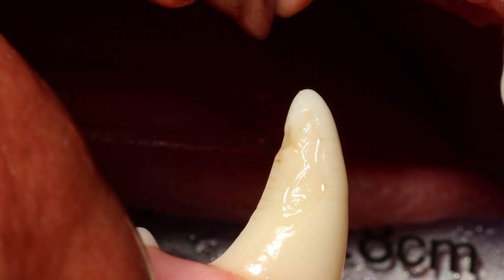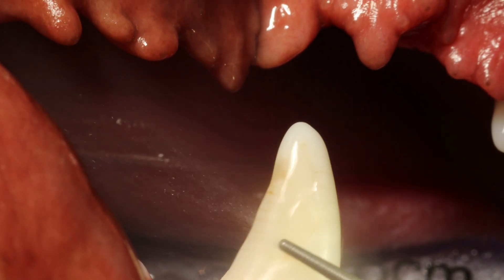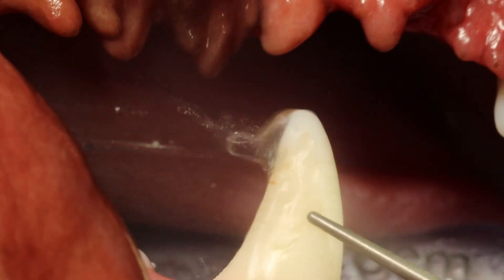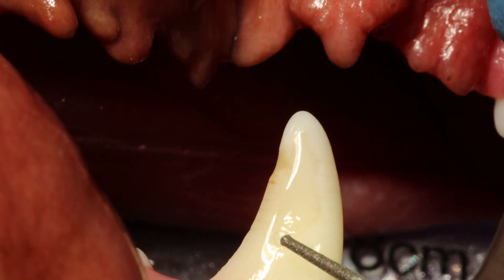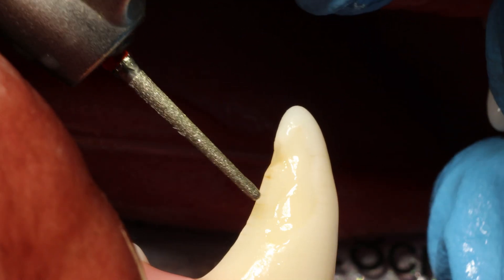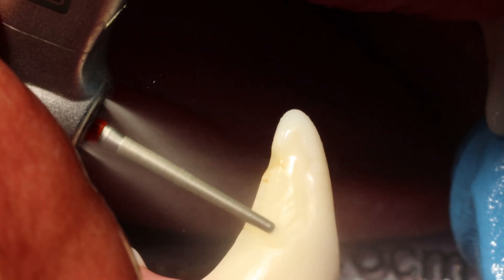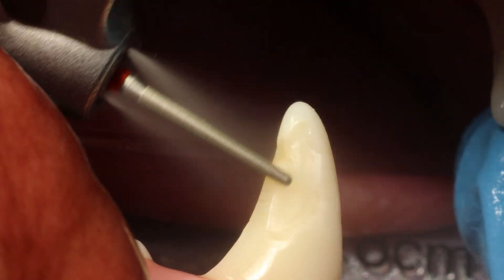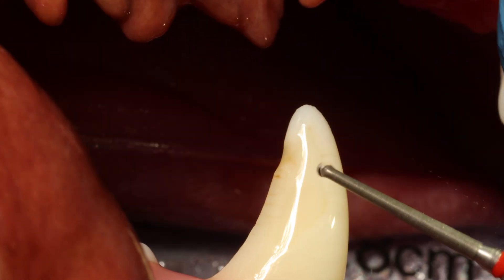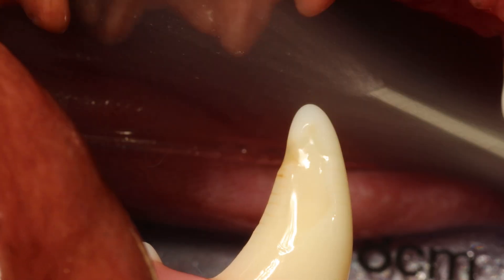For the next step, I want to bevel the edges to make the surface for the restoration a little bit larger — it helps with retention of this restoration. You just want to bevel the edge at about 20 to 45 degrees, just to make that edge an oblique angle so your restoration has a larger surface of enamel to attach to.